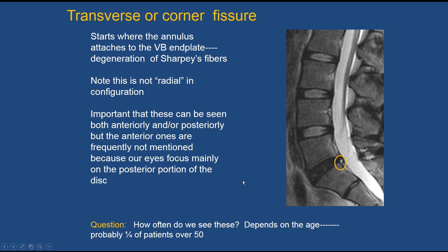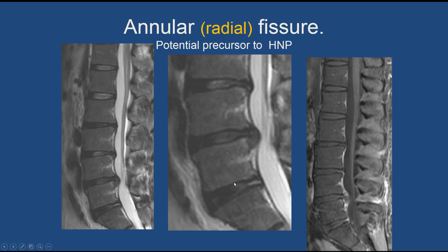How often do we see these corner fissures? Probably about 25% of patients over 50 years of age will show either a corner fissure or a concentric fissure. The important one is the radial fissure — you can see here how it goes through the entire width from inner to outer layers, providing an egress for nuclear material to herniate through. On this post-contrast study, there is enhancement around the radial fissure. It has been proposed that when enhancement is seen around a radial fissure, those patients are the ones with pain associated with the fissure; no enhancement suggests it may not be an active fissure.